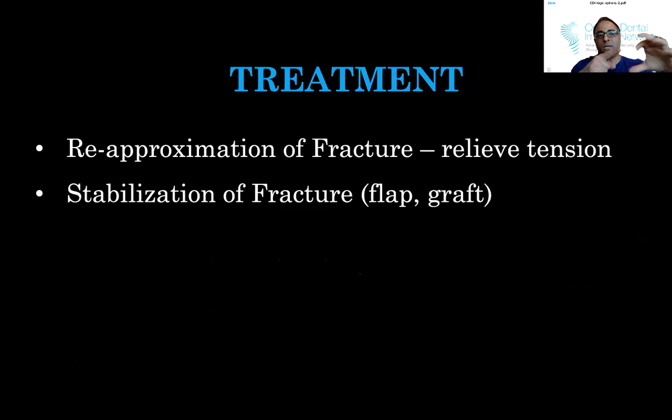So if you're placing an implant, you notice the buccal plate is fracturing or something like that, then you want to relieve the tension. And with a tapered implant, as it gets placed more into the bone, that's where that tension is going to happen. So for some cases, I'll relieve the tension on the crest, because that's where you're going to start noticing that buccal plate fracture.